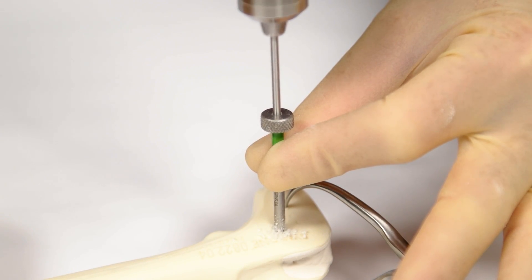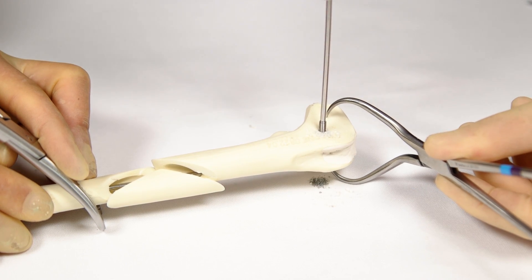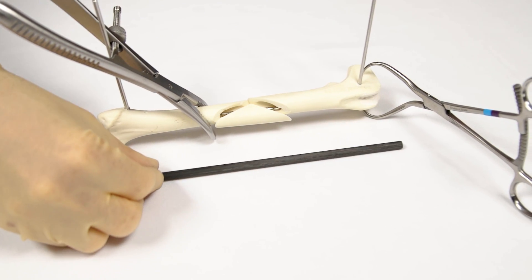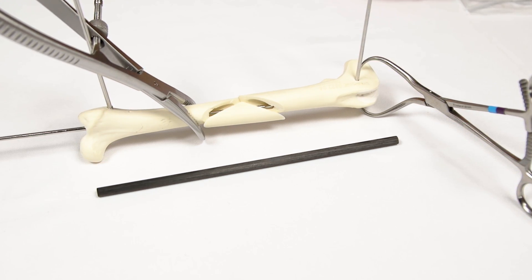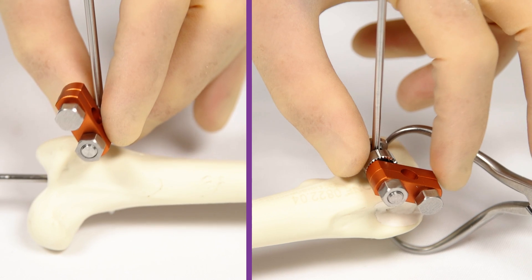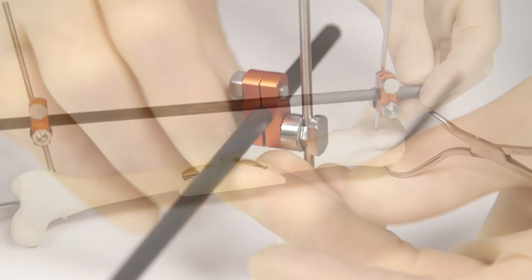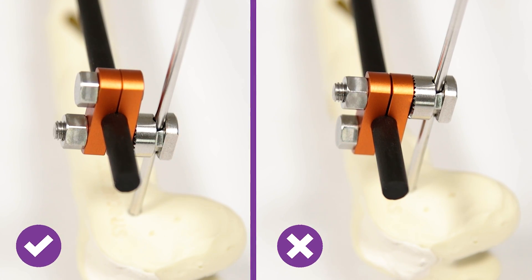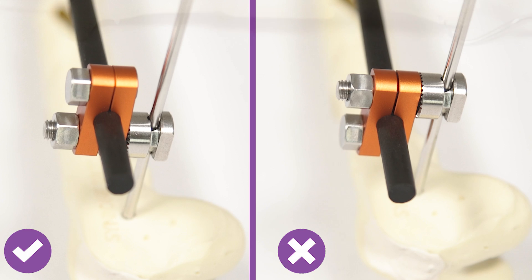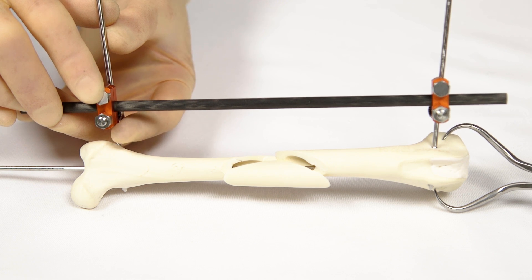With the most proximal pin in position, the most distal pin is placed next in the femoral condyle. A connecting bar is chosen of appropriate length — at least the length of the normal femur and ideally a little longer proximally. A single standard fixator clamp is used to connect each pin to the connecting bar. The orientation of the clamp is important: the pin connecting bolt must be on the inside of the connecting bar, not on the outside. The clamp must be positioned at least one centimetre or one finger width away from the skin to allow for soft tissue swelling and to prevent irritation.